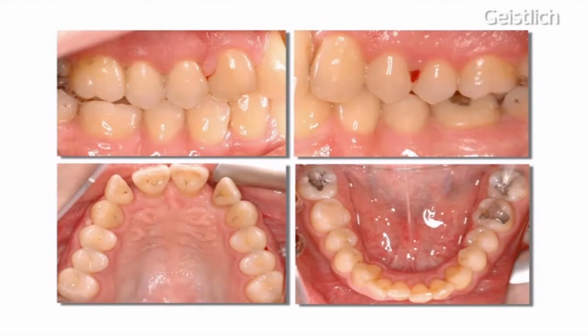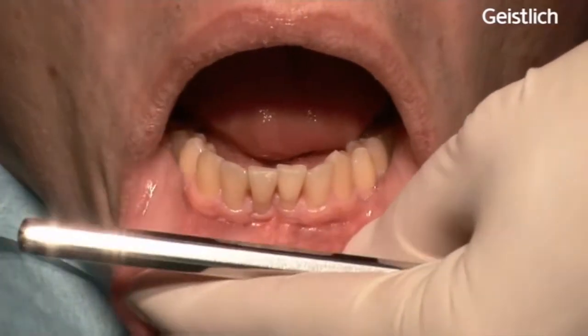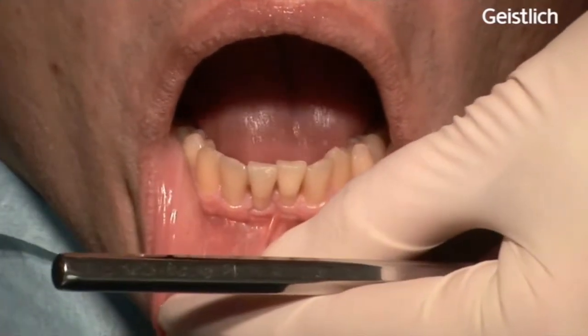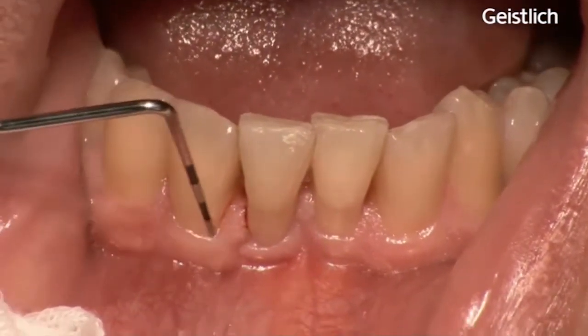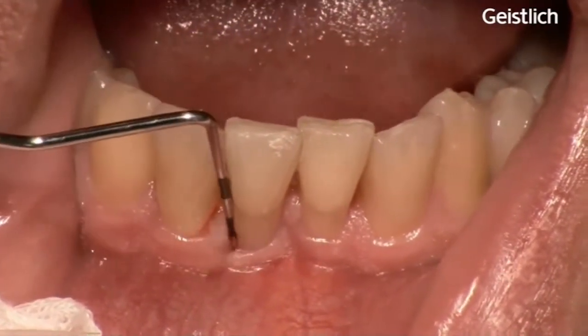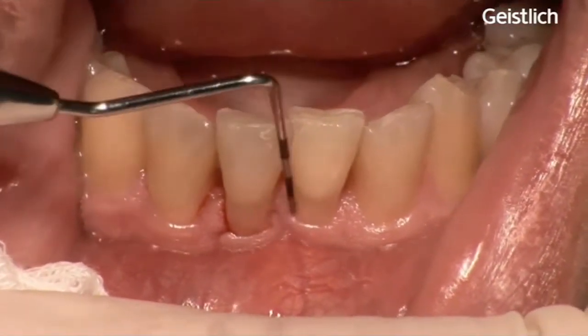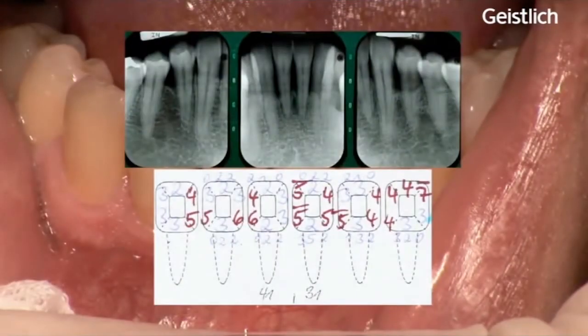In order to continue with periodontal therapy, areas with mucogingival problems need to be corrected. In this patient, an adequate band of keratinized tissue is necessary in the lower front, as you can see from the measurements with a periodontal probe, especially on the lower right incisors. The rationale for the surgery is a gain of keratinized tissue in areas with pseudo-pocketing, for vestibular depth, stability of the tissues, and for oral hygiene control.